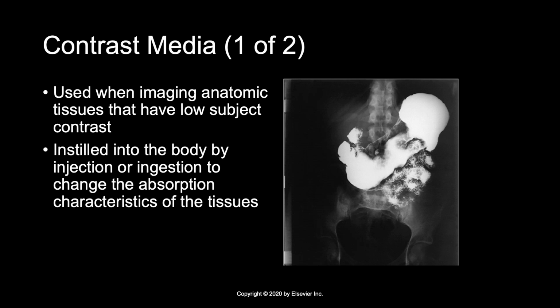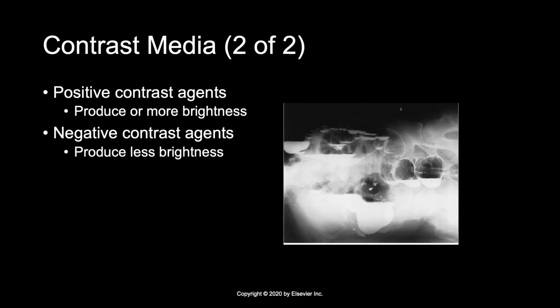This picture here is a radiographic image showing increased brightness because of the increase in the X-ray beam attenuation, because we've used a positive contrast agent. Positive contrast agents are going to produce more brightness, and negative contrast agents produce less brightness.